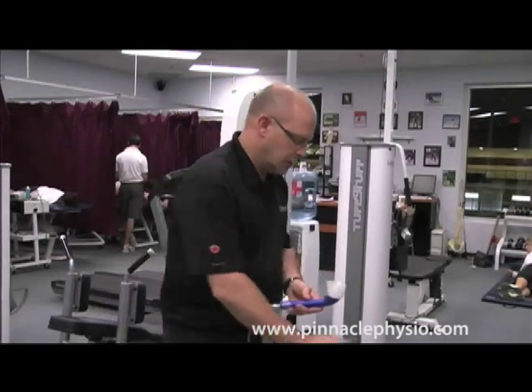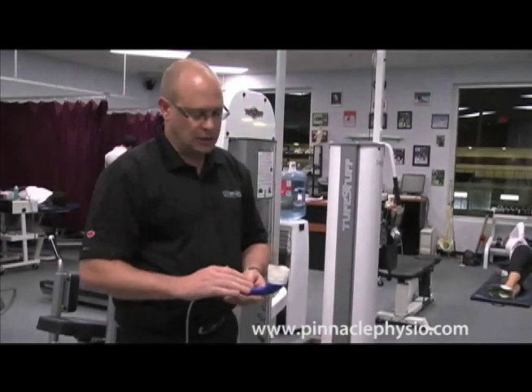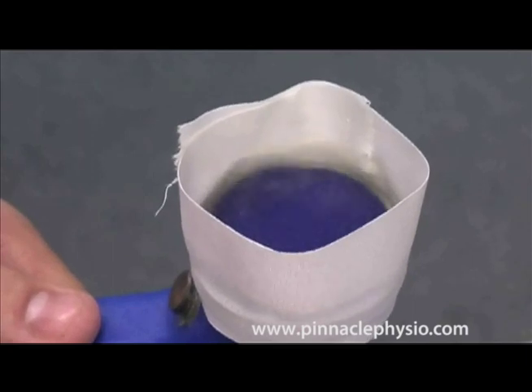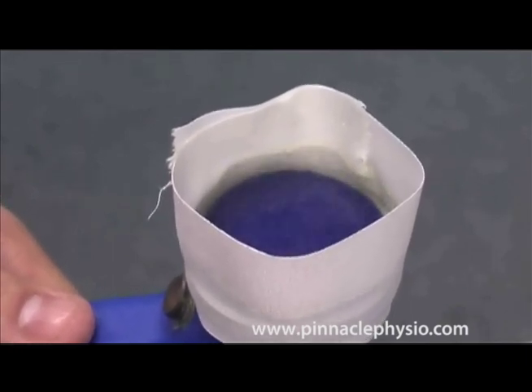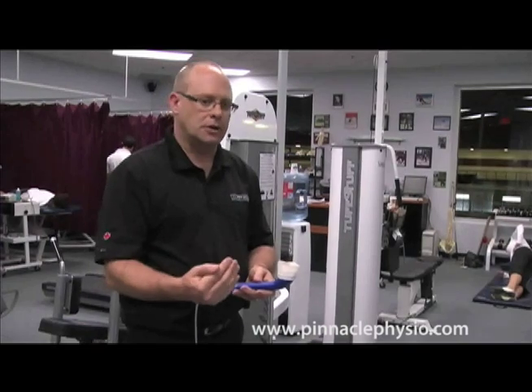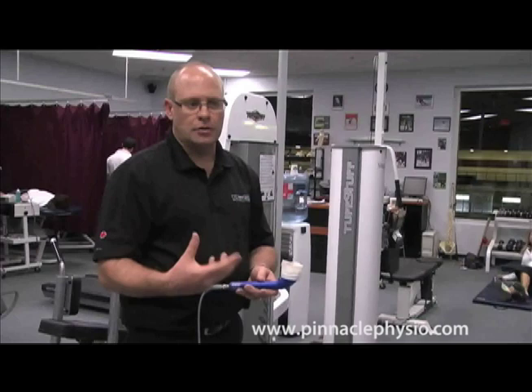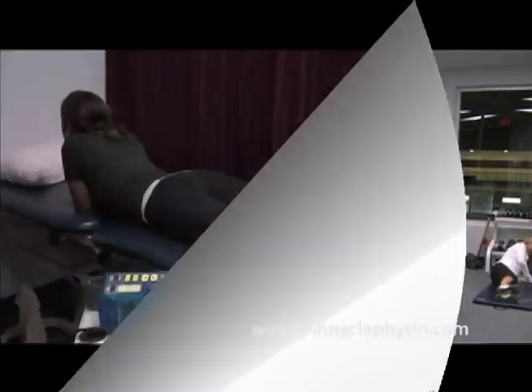We put some water in here and turn the sound head on, and what you'll see is the water vibrating — that's the sound waves agitating the water molecules and making them move. That has a bunch of physiological effects in the body, which will decrease swelling, increase cell activity, and also if we're trying to do some heating of scar tissue, we can set this to do heating inside your body as well.